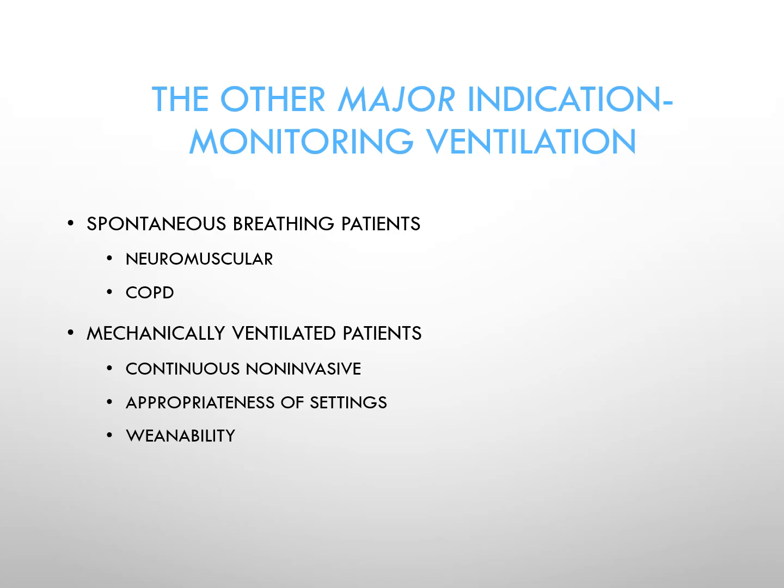Also with mechanically ventilated patients, end-tidal can be very useful when, for instance, patients are being assessed for weanability. If their end-tidals are very high, they may not be a candidate for weaning. Or if they are weaning, and we see a trend where their capnography is increasing over the course of hours during the day, they may be tiring out. They may need to be put back on full support.